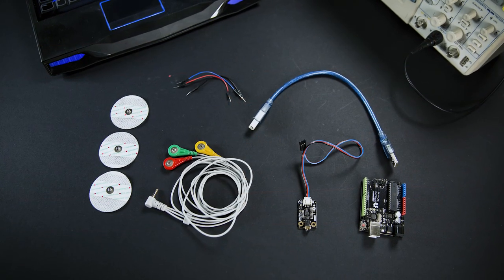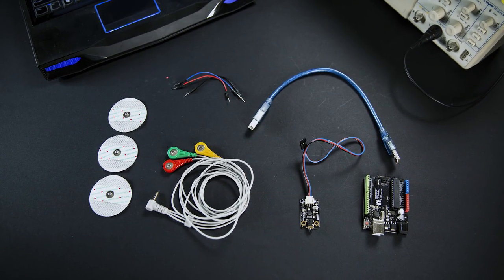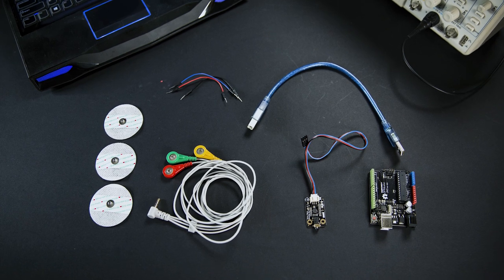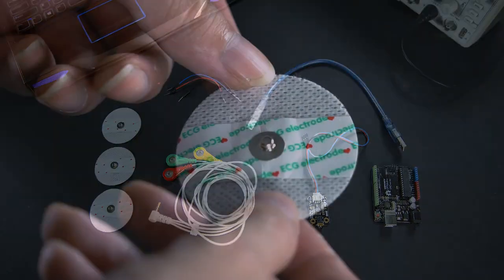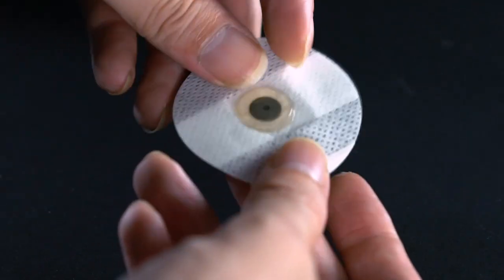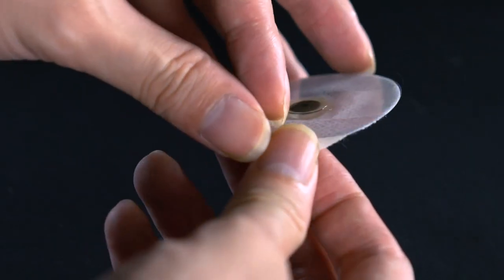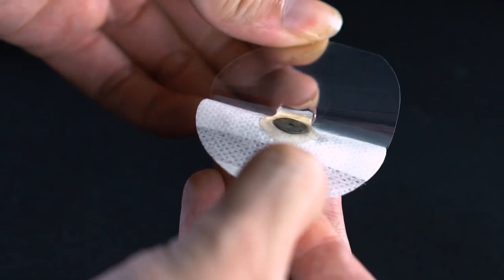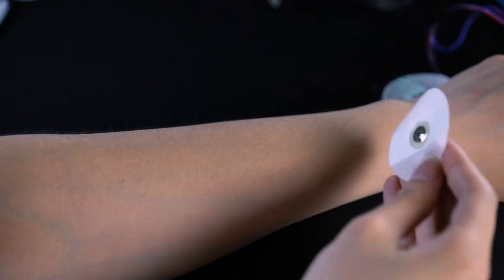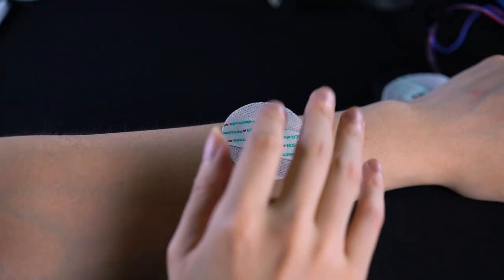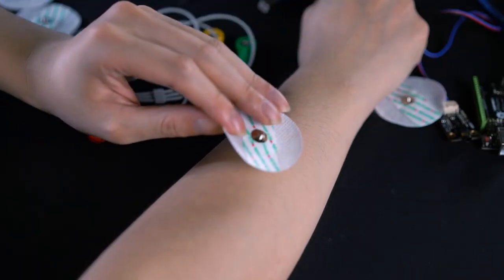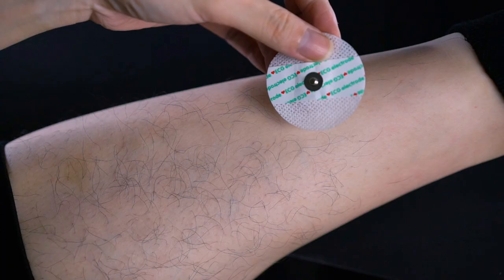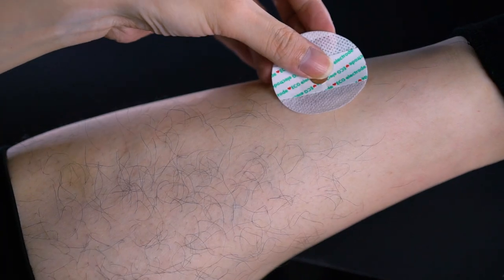Now, it's time to start building our Arduino ECG monitor. First, peel off the plastic layer and stick the conductive pad onto your body. One on left arm, one on right arm, and one on right leg.